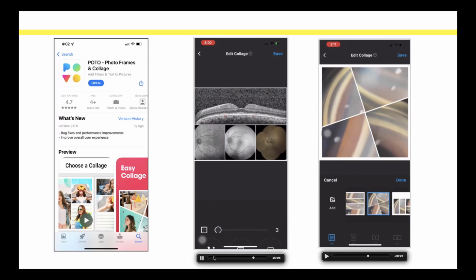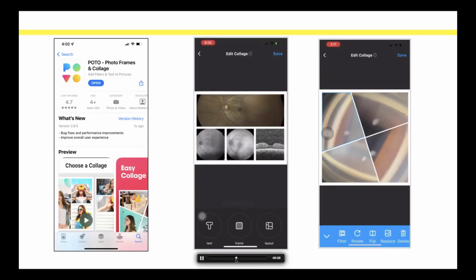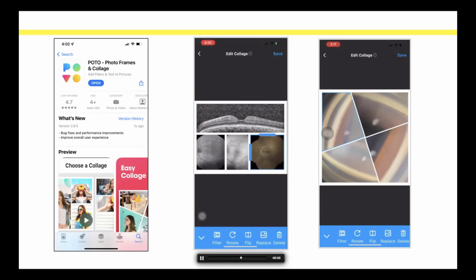Again, on the left-hand side, to summarize this image, it started from the smartphone where I'm marking, and I'm collaging it in templates which will give me a good end result. So this is something which works well in my hands. This is again an application which has some AI features which will really help you in your documentation journey and also your image enhancement journey as well.